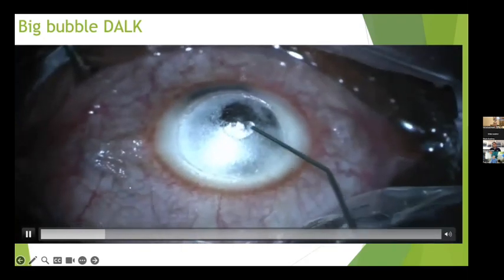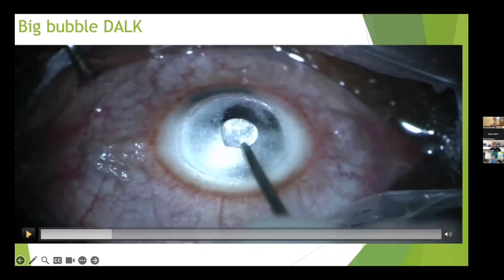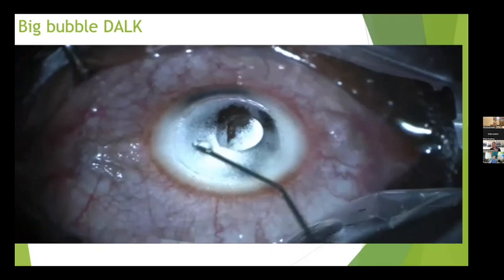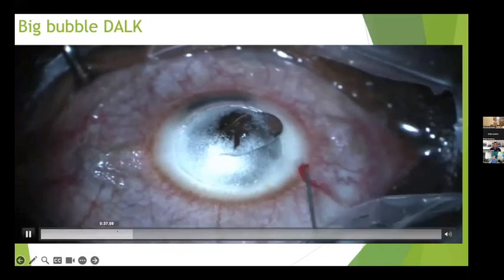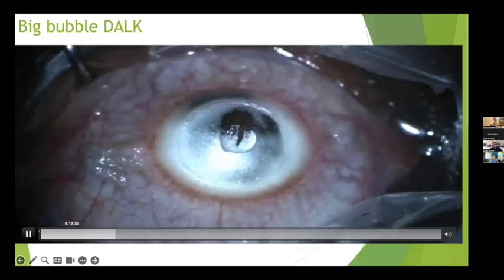And then the next step, which is the Brave slash, essentially you put some viscoelastic where you want to cut that superficial cornea, to reduce the amount of air coming out and the chances of getting the Descemet to hit the blade. Now I want you to see this, so I'm going to just go backward a little bit. This actually was in the early phases.